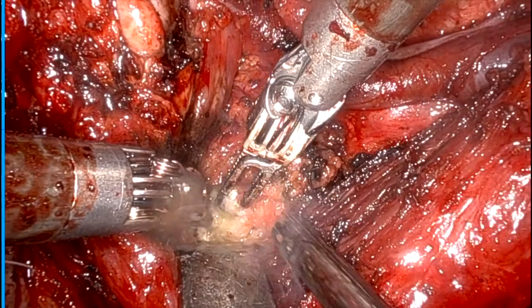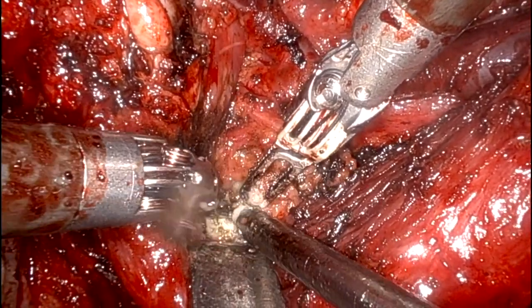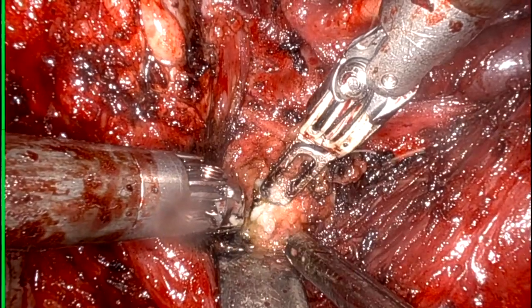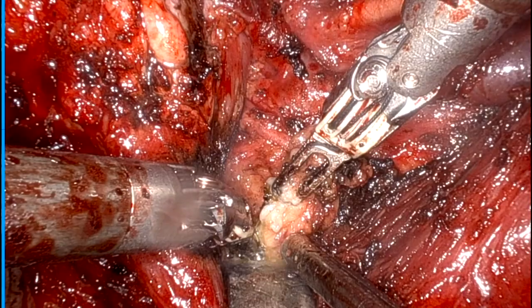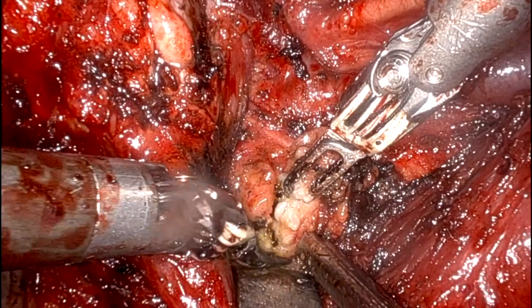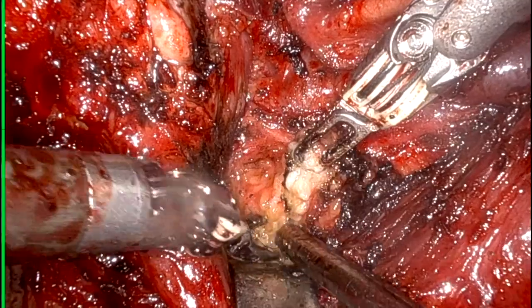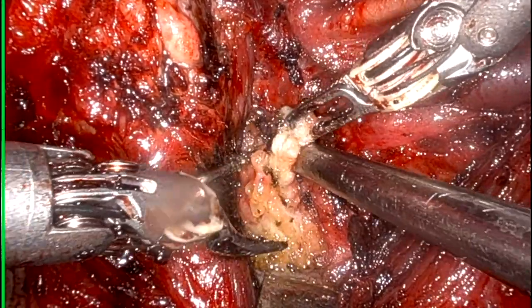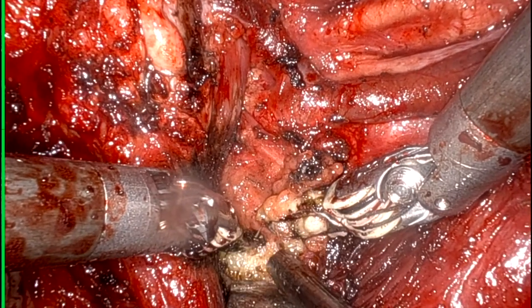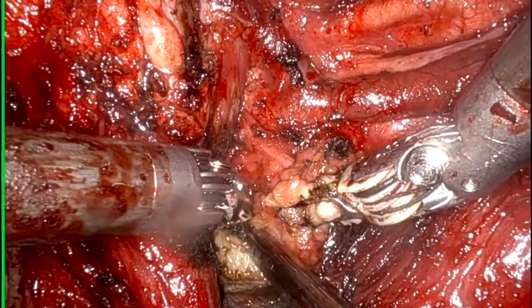Correct placement of the retractor is the single most important thing while doing level 2B. And the second important thing is constant suction. Look how helpful suction is.